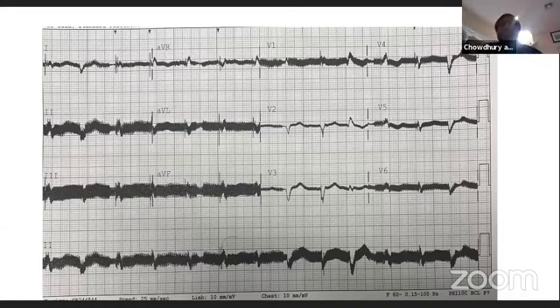So this EKG is interesting, because the cath lab technician asked me to repeat the EKG because of the baseline artifact. He repeated it, and is still getting the same thing, and gave me this EKG. What do you think was happening here? The patient is, there is no artifact that the echo tech could find out, because he tried many times and got the same.